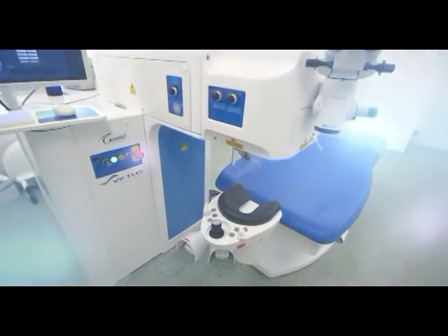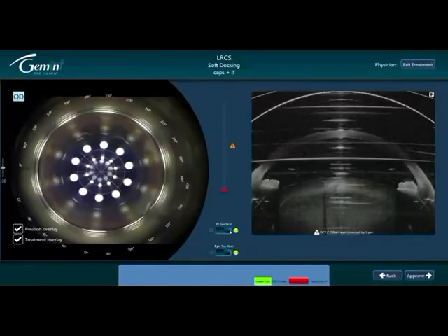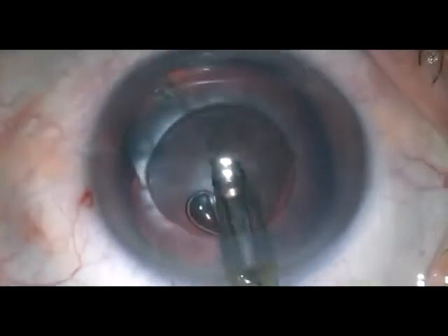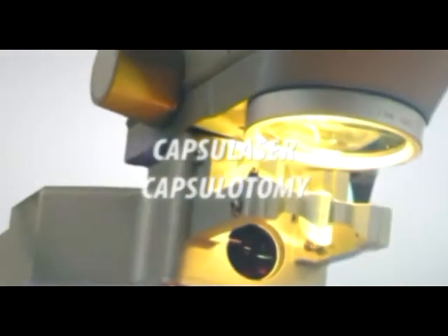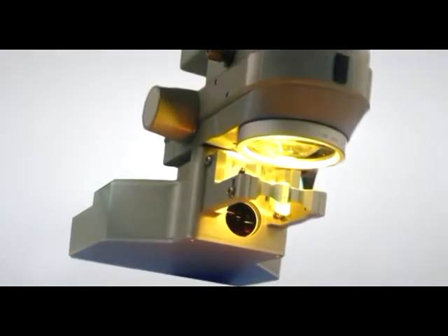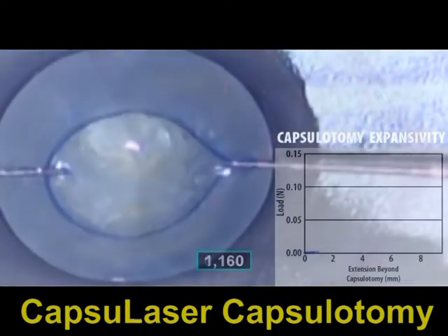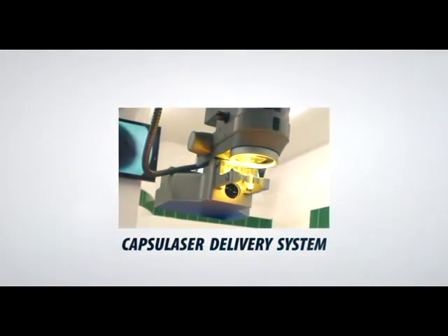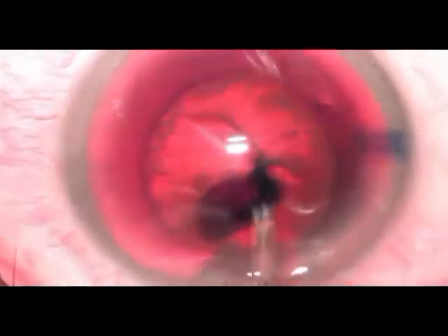A femtocapsulotomy being performed here demonstrates that despite all its limitations, the femtolaser achieves a perfectly round capsulorexis. The capsule laser is not yet commercially available and has not received FDA approval. It fires a laser in a single continuous circular pattern, producing a strong rexis. The capsule laser can be attached to the operating microscope itself, so no separate large machine or room is needed, making it quite portable.